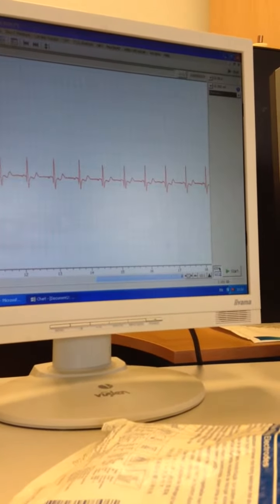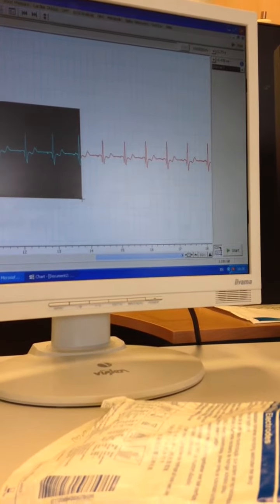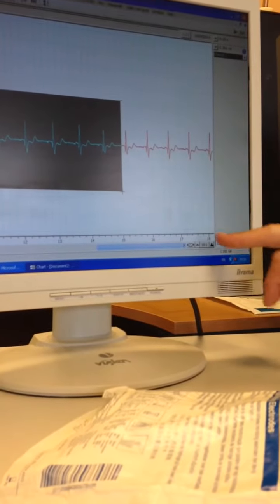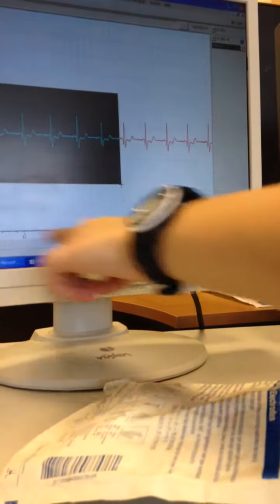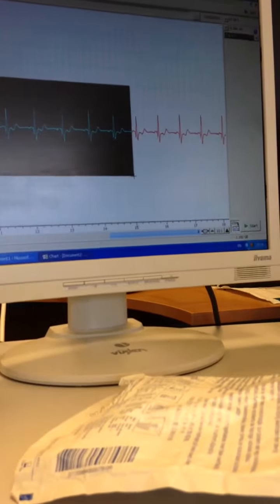Then close all of that and highlight the section you want. It's according to time, this is the second. So you identify the period during which they're being interviewed. Yeah, you'd have to mark it, and make sure you prepare for that.